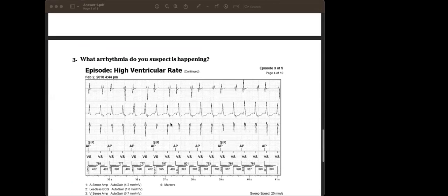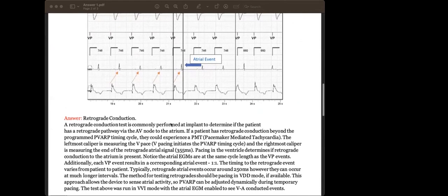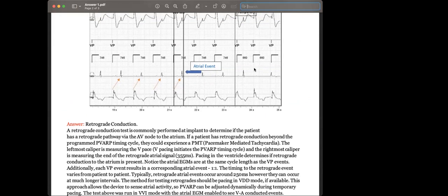Just really quickly, AJ. Yes, sir. I've noticed, I don't know if Jarrad is seeing this in Boston devices. It's really odd because always when you see PMT, you see 5 of them. 5 PMTs logged in a stored arrhythmia, always with Boston devices. You don't tend to see it much with other manufacturers. We're thinking, why is it Boston? Almost every second or third patient has got PMT.